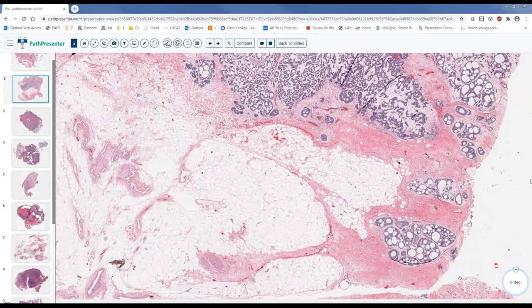Basaloid squamous cell carcinoma. Very, very excellent question. That is one of the occasions where we do immune stains. First of all, in basaloid you will see the palisading. Let's say the solid variant of adenoid cystic carcinoma versus the basaloid squamous cell carcinoma, based on core needle biopsy.